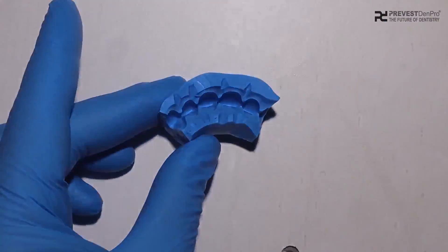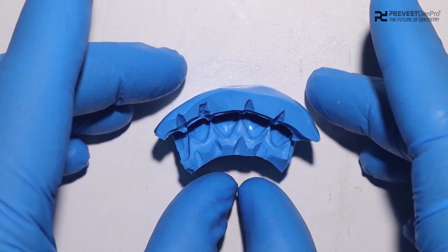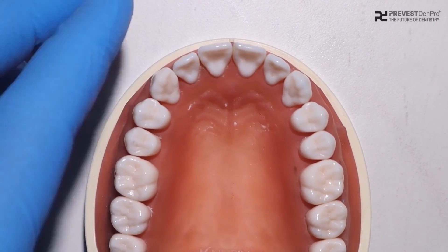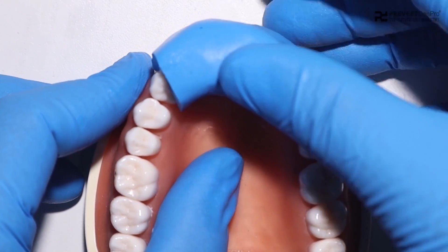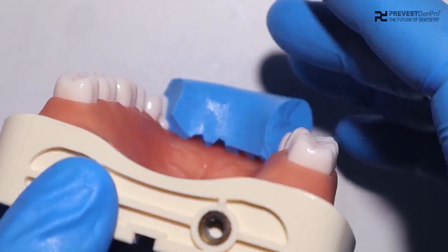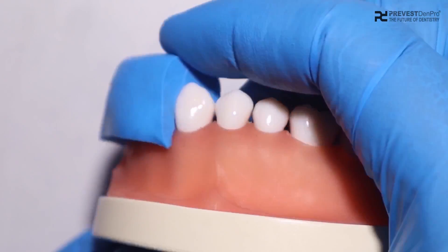After removing the excess and preparing the grooves, we are ready with the putty index. Once ready with our putty index, we can check it on the cast and see that there are no spaces between the teeth and the index. If there are any spaces, then we need to repeat our impression with putty again.